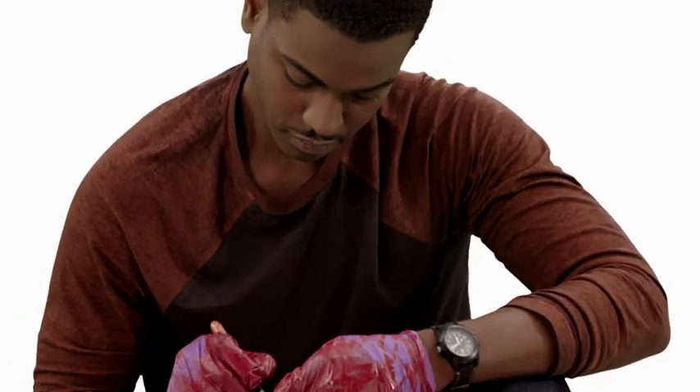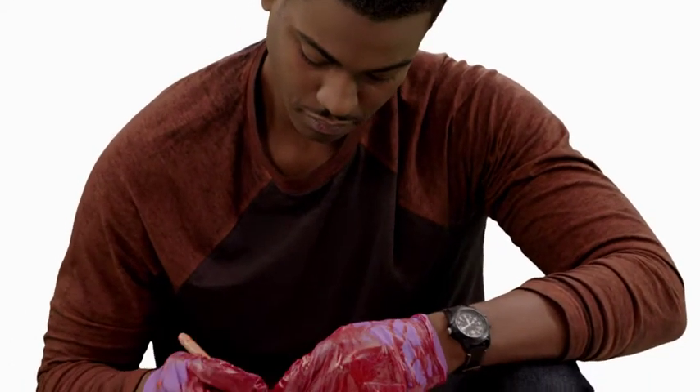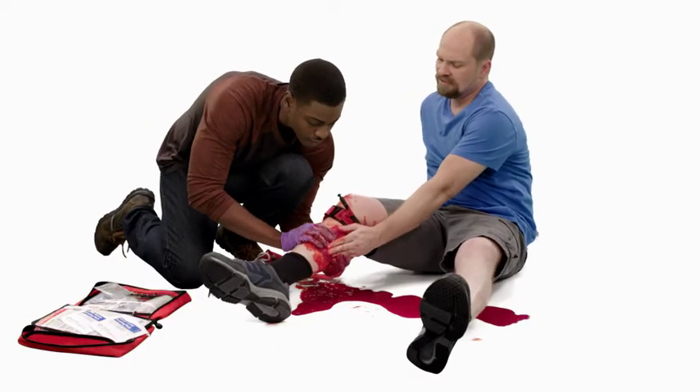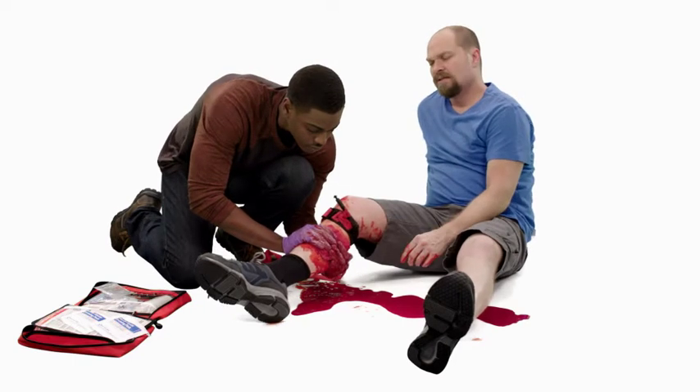Note and record the time that you applied the tourniquet and give this information to EMS personnel when they arrive. Continue to care for the person and monitor for shock until EMS personnel arrive.